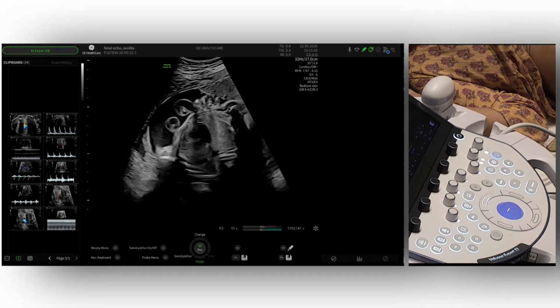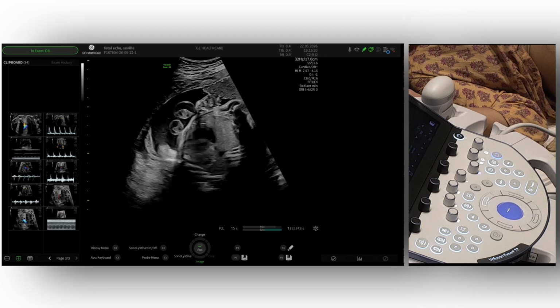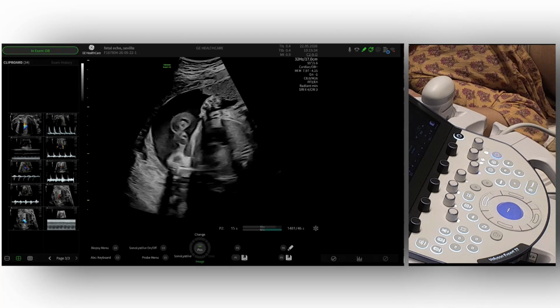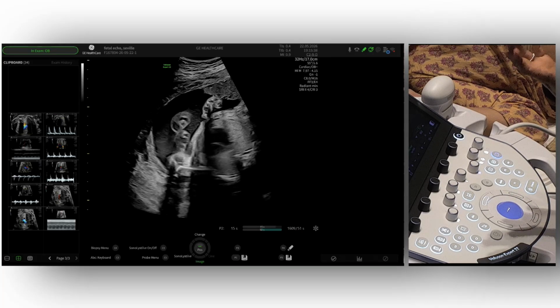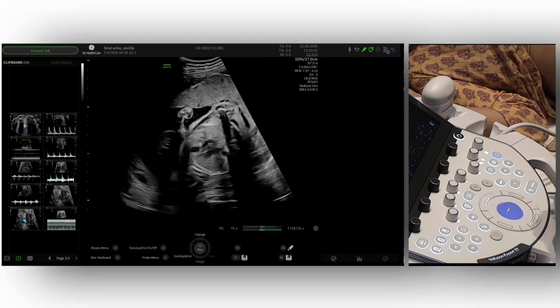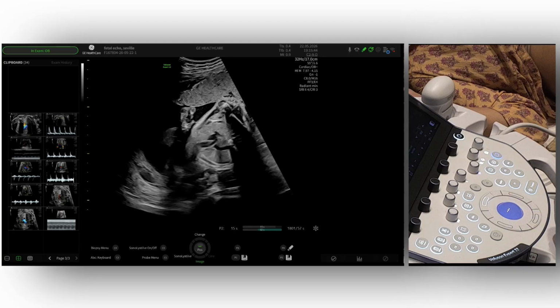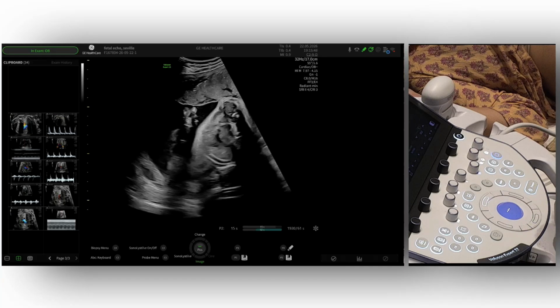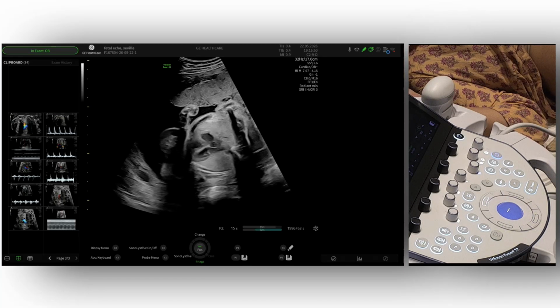No, actually, you don't need to do all three. You just need to do one, well done, so that you really get the relation. The information you are getting is similar in all of them. What you need is to get one well done, so you can really see the atrial and ventricular contraction at the same time, see the relation, and measure.